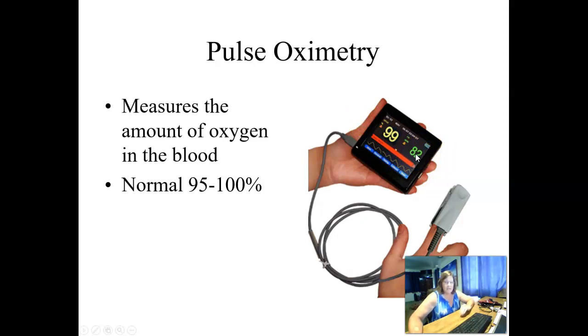Something's not reading right. It doesn't have to be the exact same value because your heart rate fluctuates continuously, but it should be in that range of close nearby, probably within 10 points of what we got. If it doesn't, I would have to question if this is giving you an accurate measurement. Or let's say I got 70 for a heart rate and it's recording 100, or I got 100 and it's recording 70. That's telling me it's not picking everything up correctly. So that heart rate is kind of nice because it's kind of an indicator for you as to whether or not it's reading correctly.